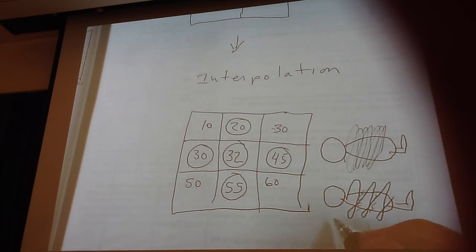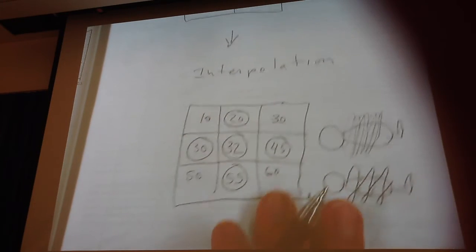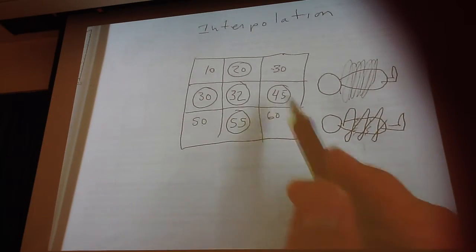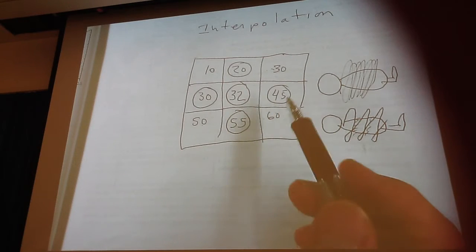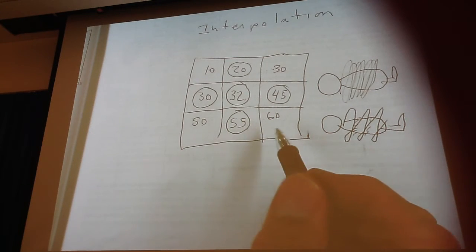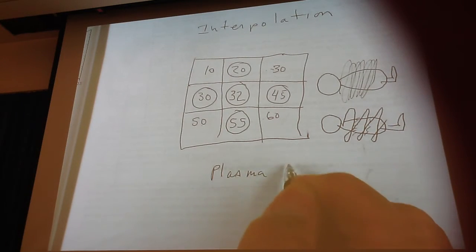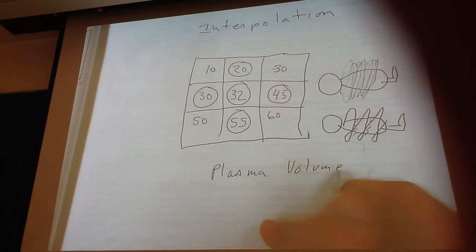So when we do helical scanning with CT, and then another application of this interpolation is something that we'll learn later when we do plasma volume calculations.